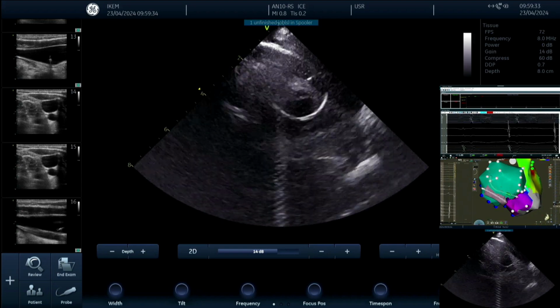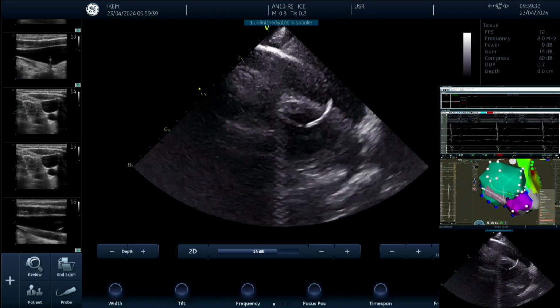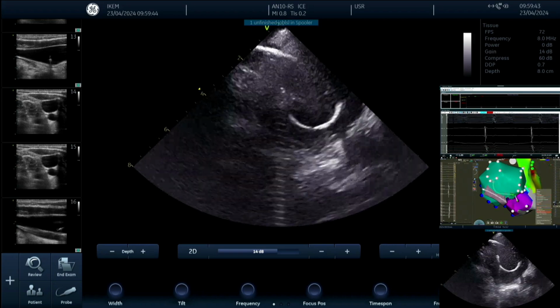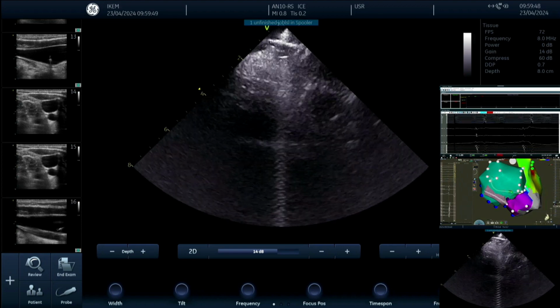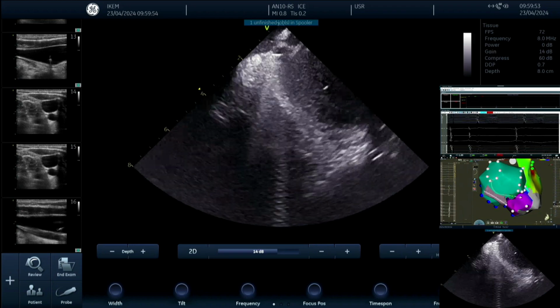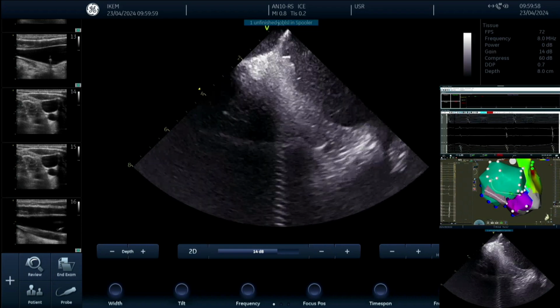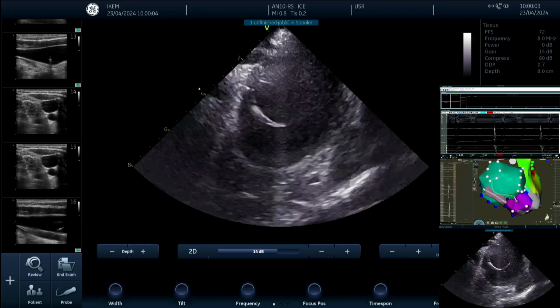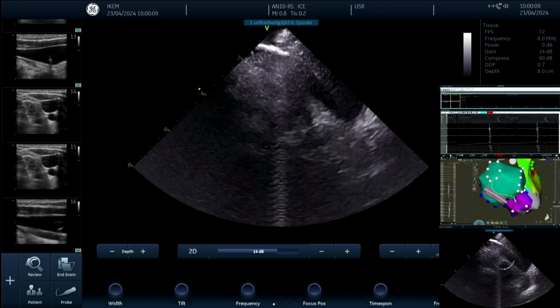Okay. If I may comment, just take a look at this ICE. ICE is a very useful tool for all kinds of procedures, including cardioneural ablation, because we can visualize the catheter on this pyramidal space that is very important for the denervation of the AV node. So Roman has pretty much the same approach as Dan, so he will burn from all sides, right? From the left atrium, from the right atrium, and also from the CS. Yeah. So now we can see how the catheter touches. There is a good contact on the triangle. Predrag will show you.